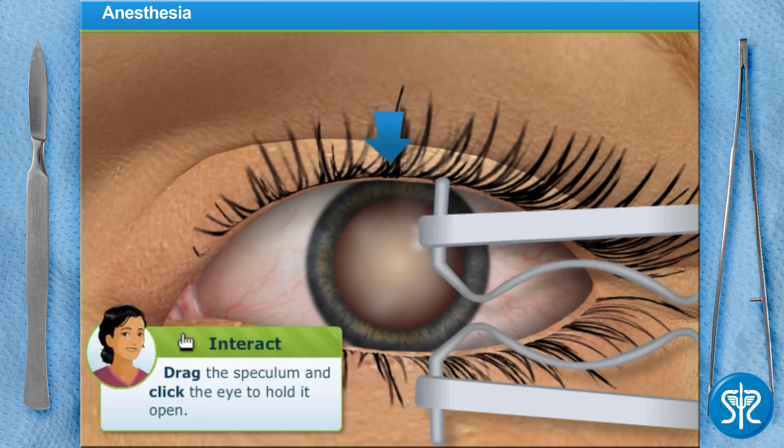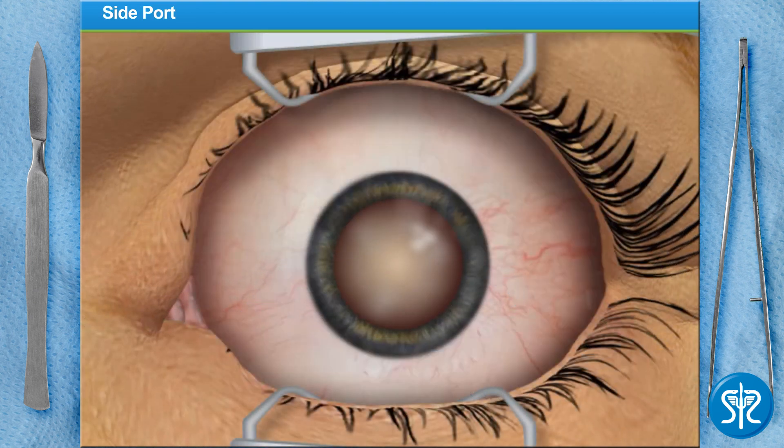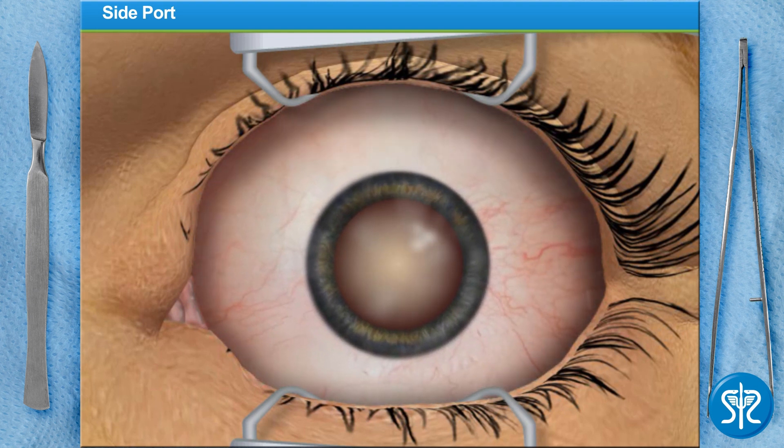Place the speculum for me, please. We begin the surgery with a small, painless initial side port incision. This is called a limbocorneal incision. It's done by making a small cut in the limbus with a crescent knife.